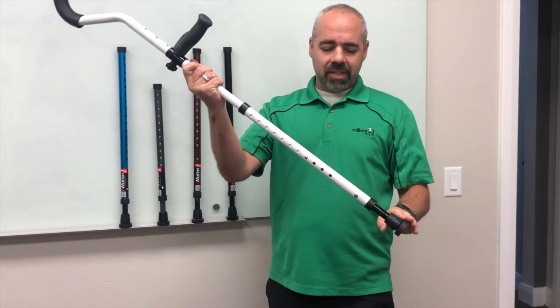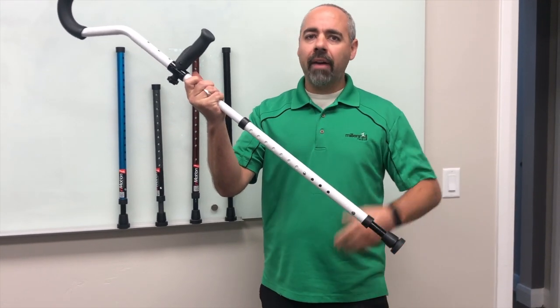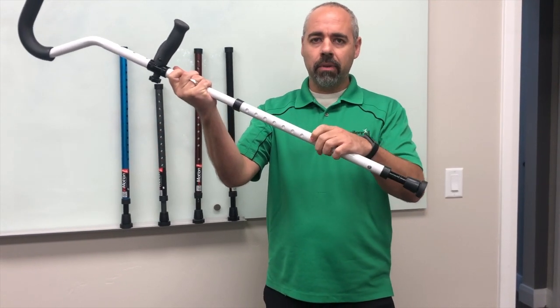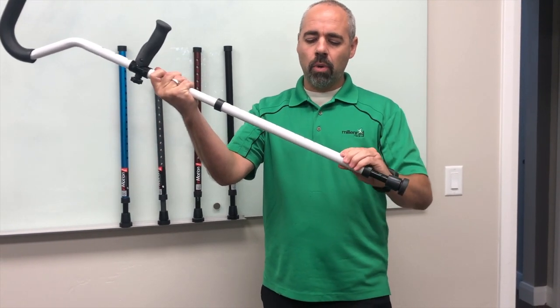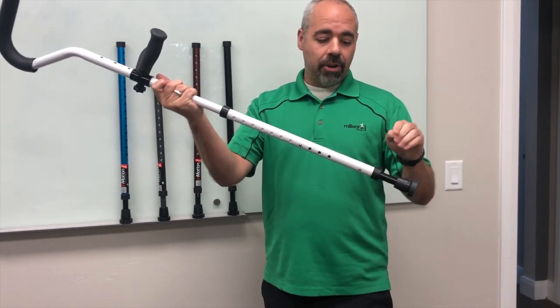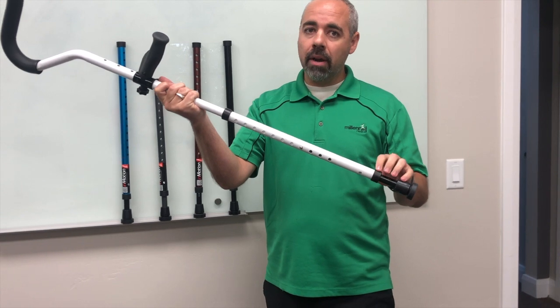Right now you have it set up with a front side and a back side. After about 30 days, press the buttons right in the middle, push them in, and rotate it 180 degrees. Now the back is the front, and you're going to get a little bit different wear and tear.